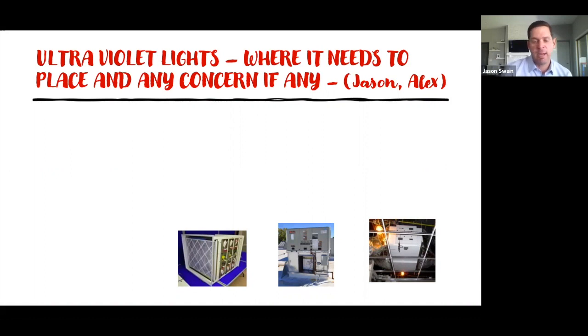And the third location is in some of our incubators. They're built internally for internal bacterial control. So again, lab staff are never exposed to the UV light in that third location.